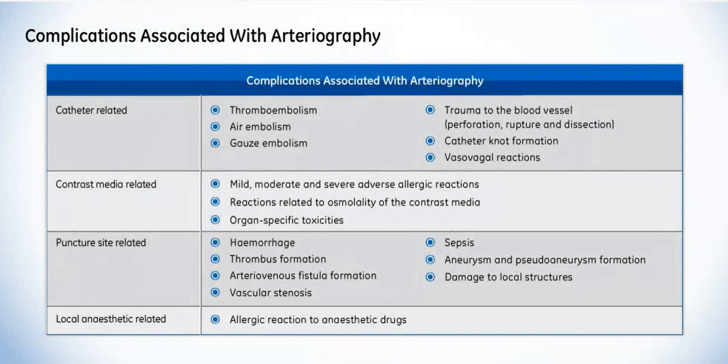Now let's look at some of the complications of arteriography. These complications can be classified into catheter-related, contrast media-related, puncture site-related, and local anesthetic-related. These complications have been tabulated on screen.